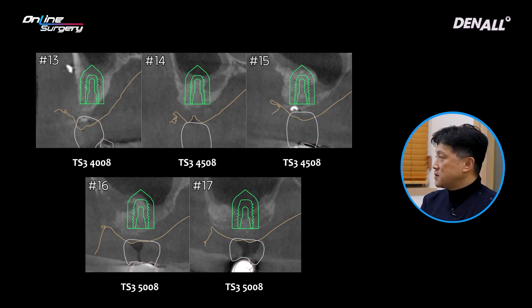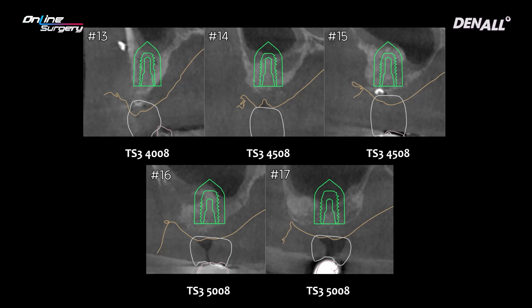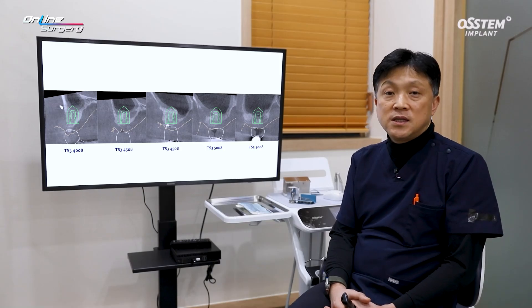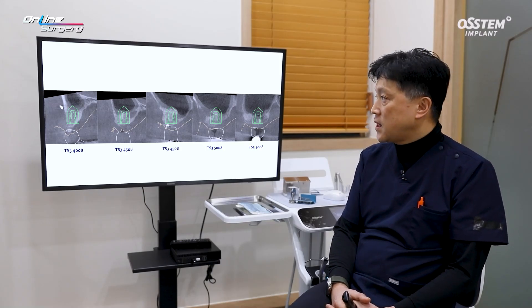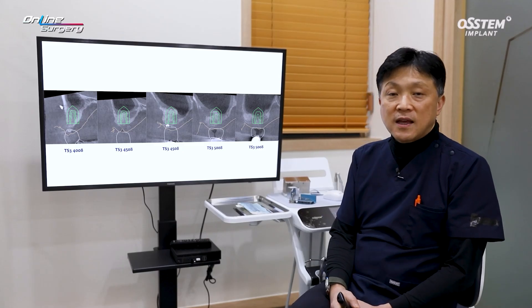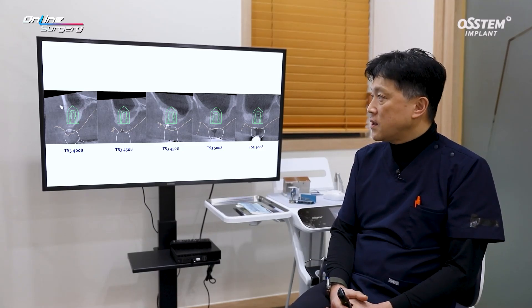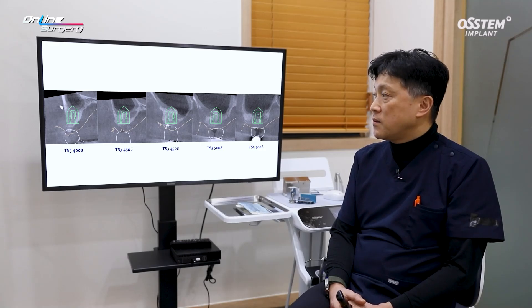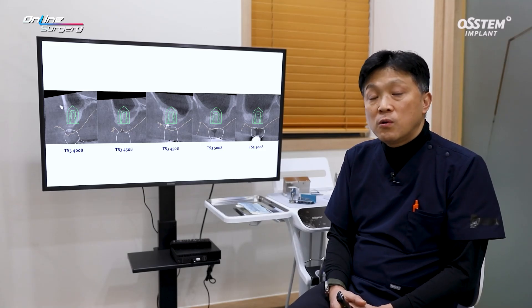When placing three of the implants, it was necessary to elevate the sinus membrane. Therefore, a surgical guide was used in placing these implants. The surgery itself was very simple and quick because the surgical guide was used. Further bone grafting was not done, so the surgery was performed flapless.